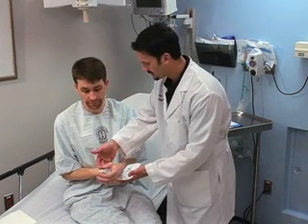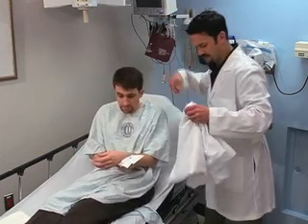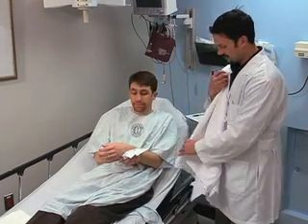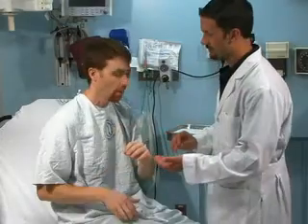Analgesics or anesthetics may be necessary to control pain during the splinting procedure. Place the patient in a comfortable position that allows you to have adequate access to all sides of the injured extremity. Remove all jewelry from the involved extremity before beginning splint placement.